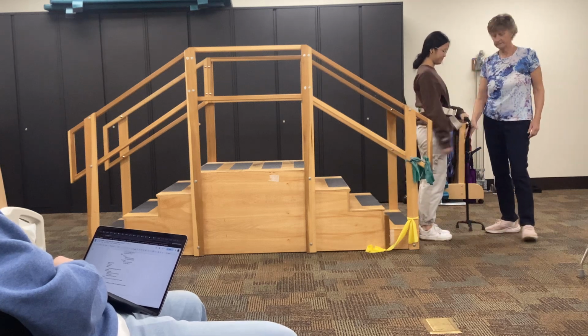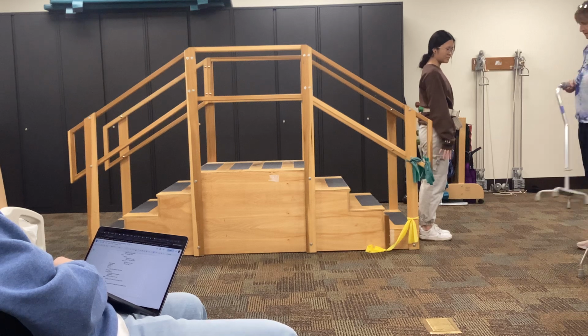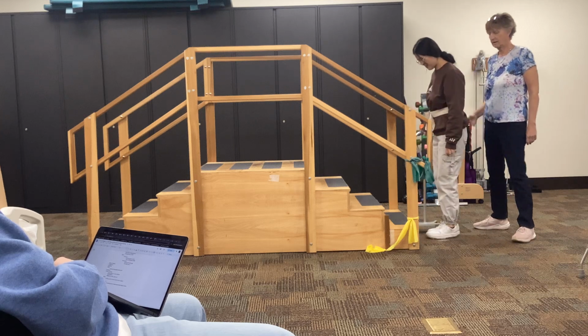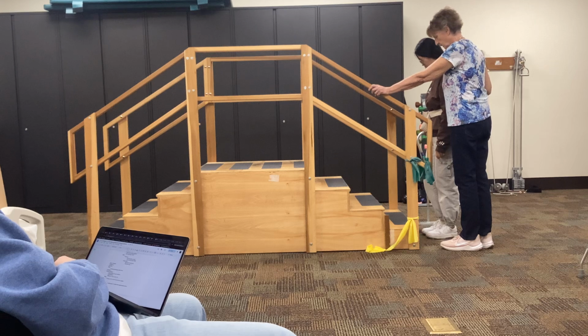Piece of cake, right? This one's set for this side, so you gotta swap sides. All right, so now your right leg is your good leg.